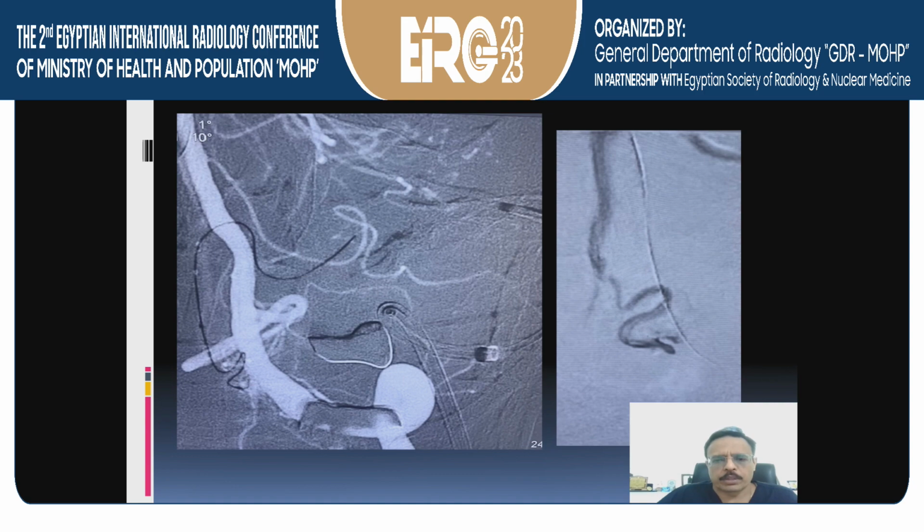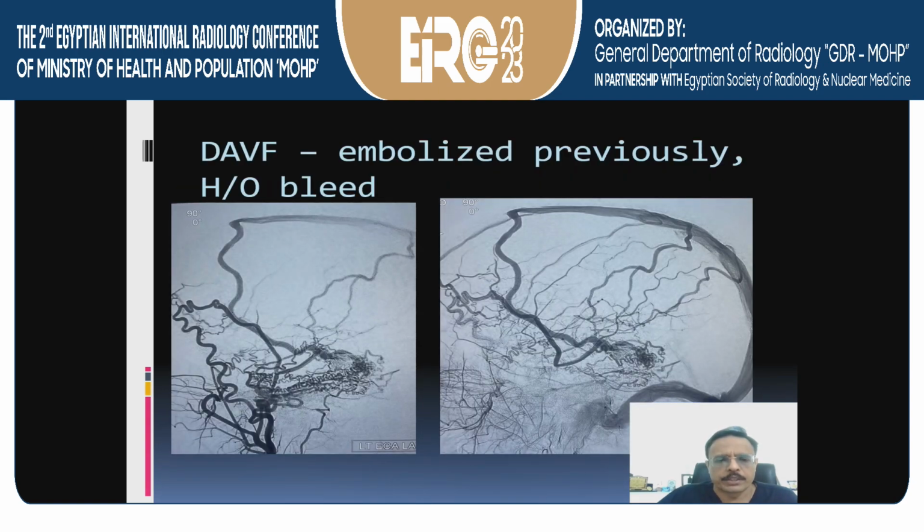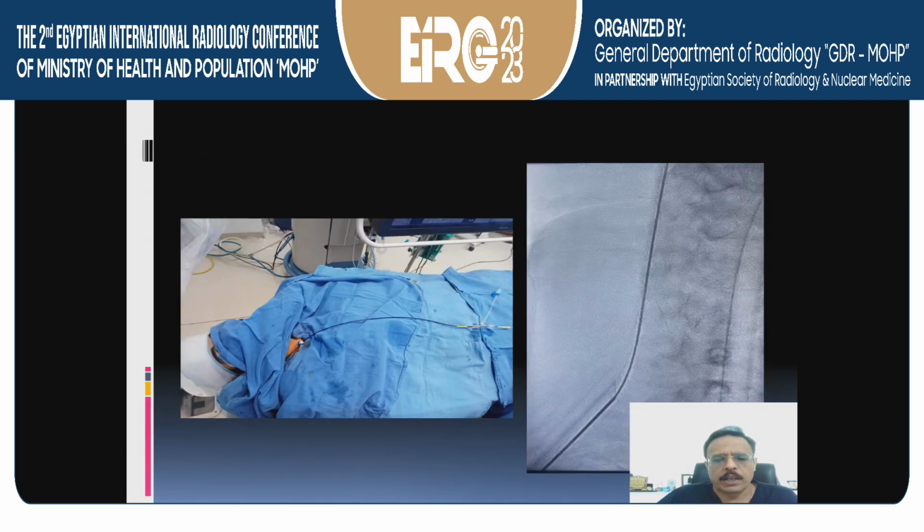And this is the microcatheter injection. Once you're there, it's pretty easy to inject in very quick time. Using detachable tip, we detach the tip and the AVM is gone in a very safe manner. Another patient treated previously, middle meningeal artery, massive collaterals, no good arterial feeder, but the vein drained into the superior sagittal sinus. So again, feeders from the pial feeders.